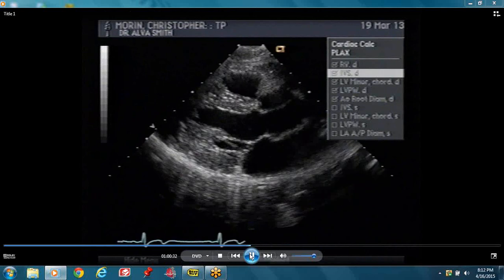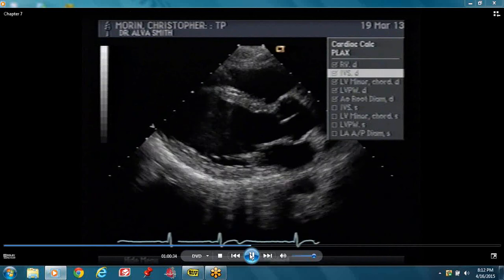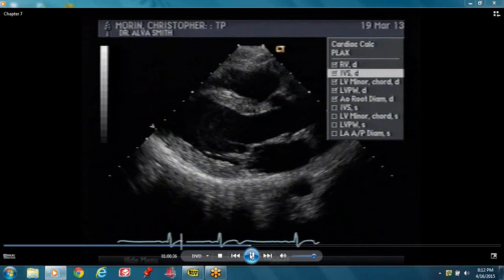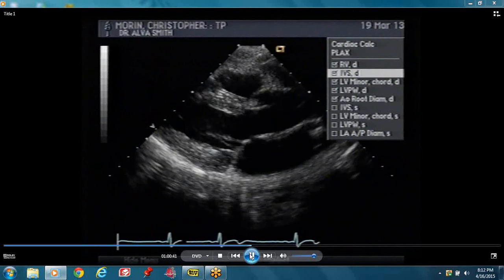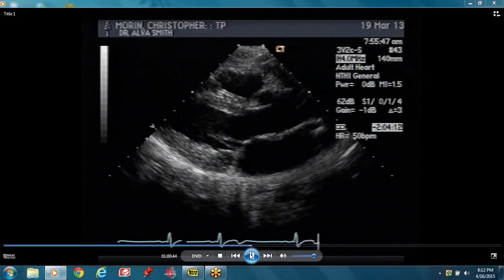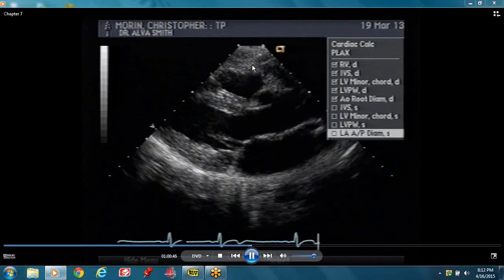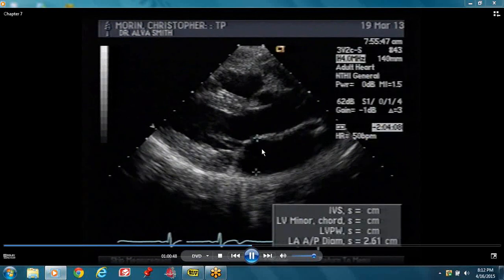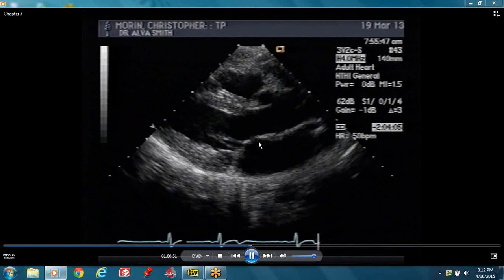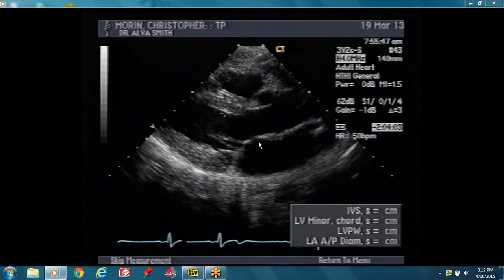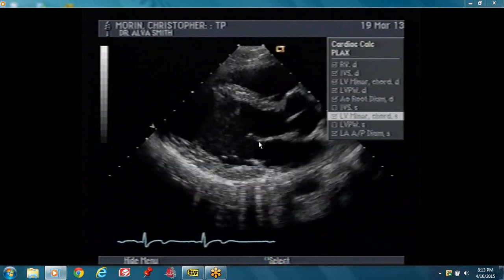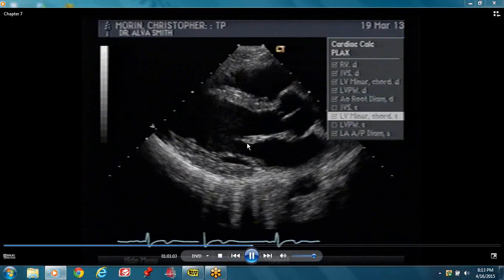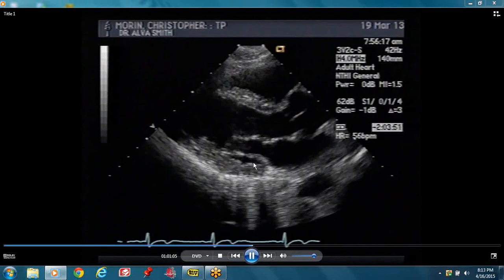So you do those measurements. Then you put it in motion and do your systolic measurements. In systole, your aortic valve is open. You measure your left atrial dimension in systole and your left ventricular internal dimension in systole. Your anterior mitral leaflet is right there, and this is the posterior leaflet.